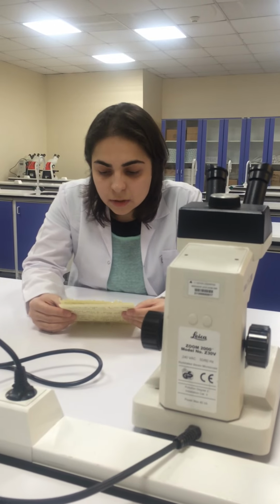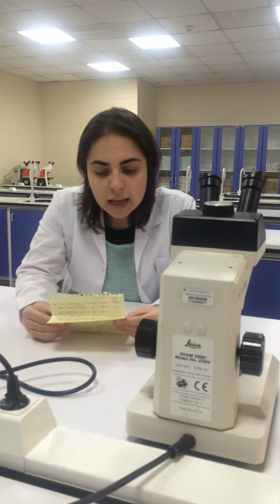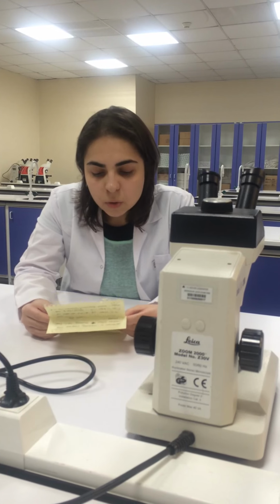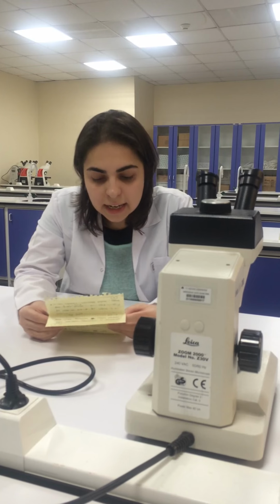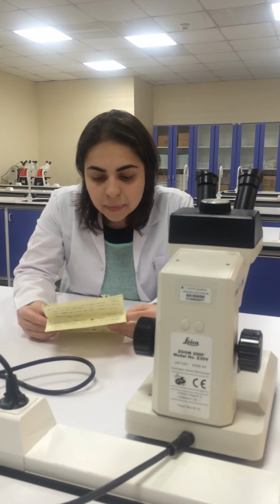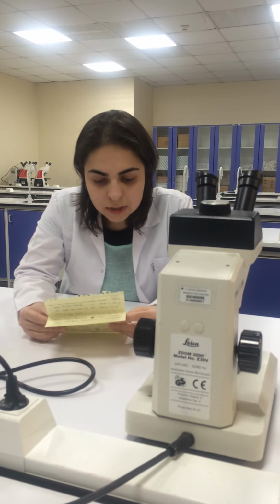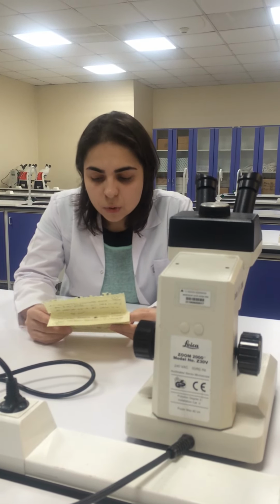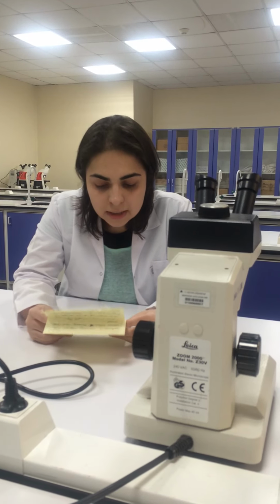Piglet is laid on a surgical table in back facing up and belly down position. All hair of piglet from neck to tail is shaved off. Pig's dorsal skin is scrubbed with povidone iodine 3 times, then iodine is left on surface for 10 minutes. Povidone iodine is removed by using 70% ethanol spray for several times. Gauze pads or tissue papers are used to clean visible povidone iodine on surface.